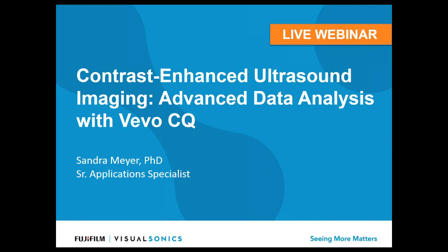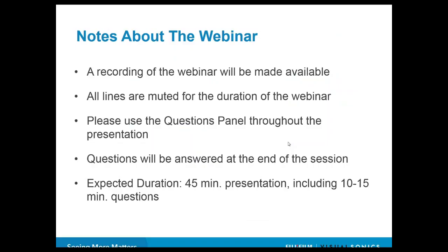Today's topic is going to be contrast-enhanced ultrasound imaging, and we'll dive into advanced data analysis with VevoCQ. And our presenter is Sandra Meyer, one of our application specialists.